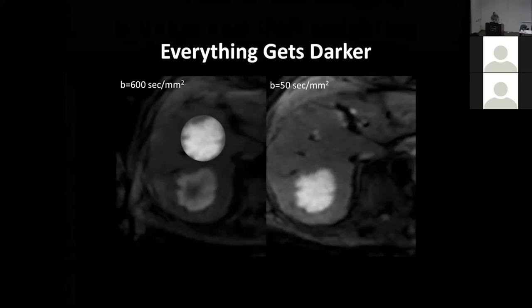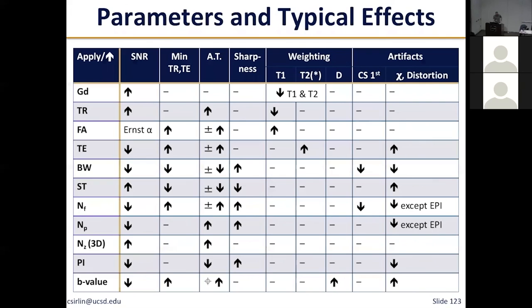Okay, so what we've talked about today in this second lecture is the effect of multiple different changes in parameters on image quality. This is a table that, if anyone is interested in this lecture, just email me, or maybe we can distribute it to all the residents, and you can read this table and go over what is the effect of different imaging parameters on different parameters of image quality in this table.